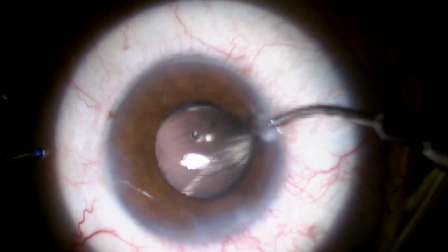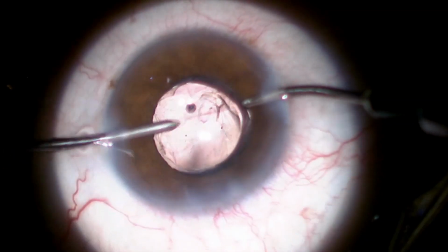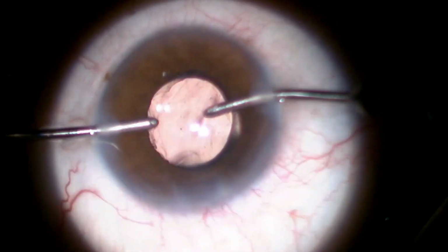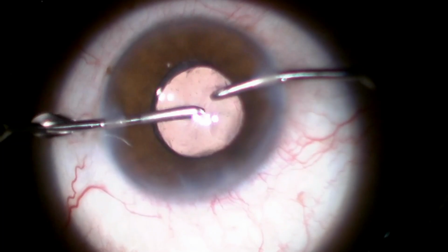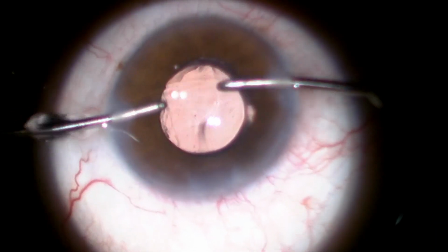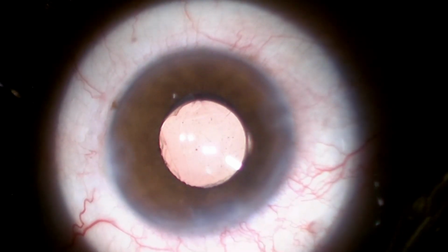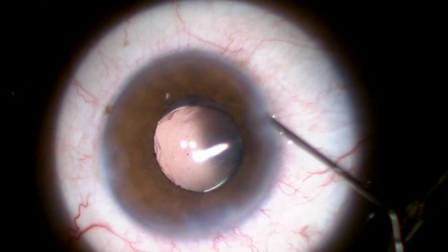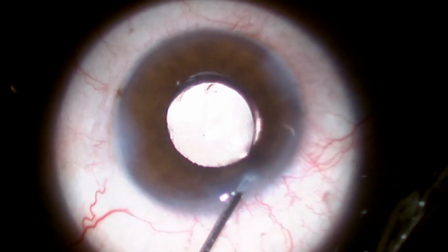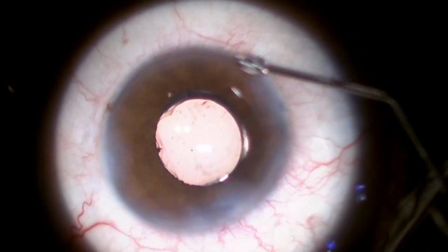Now once this IOL is stabilized, we are removing whatever residual viscoelastic is there. And once the viscoelastic is removed, we will close the section with hydration, and the surgery is complete and the lens is well centered.